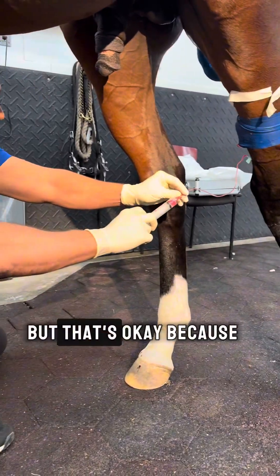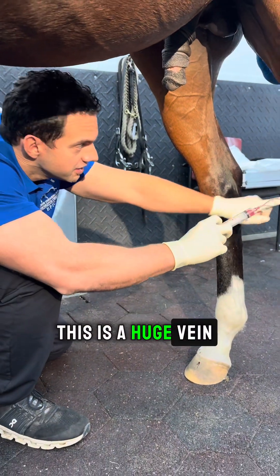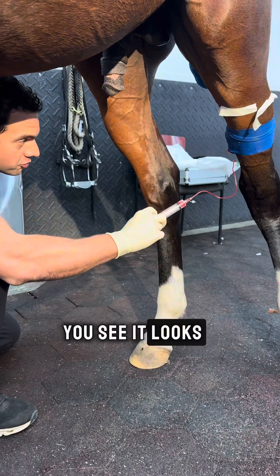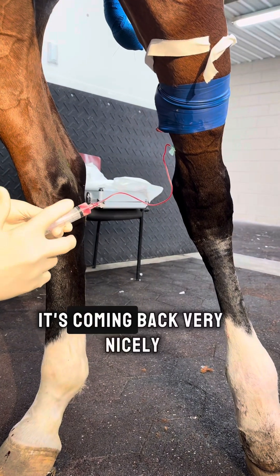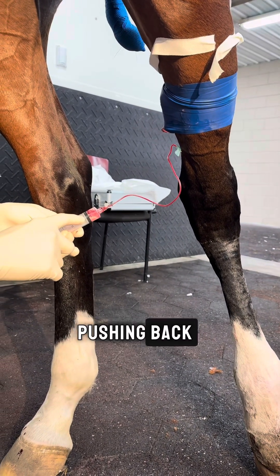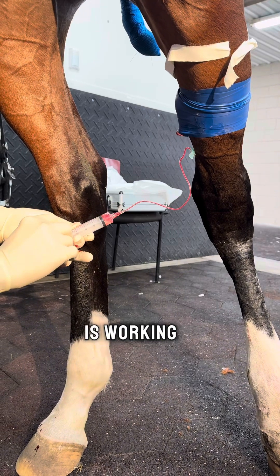I went a little fast but that's okay because this is a huge vein and I'm not blowing up the vein — you see it looks pretty good. It's coming back very nicely, you see how it's pushing back — that means the tourniquet is working perfectly.